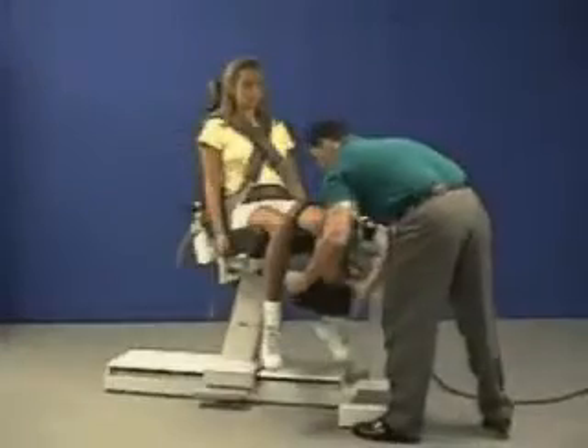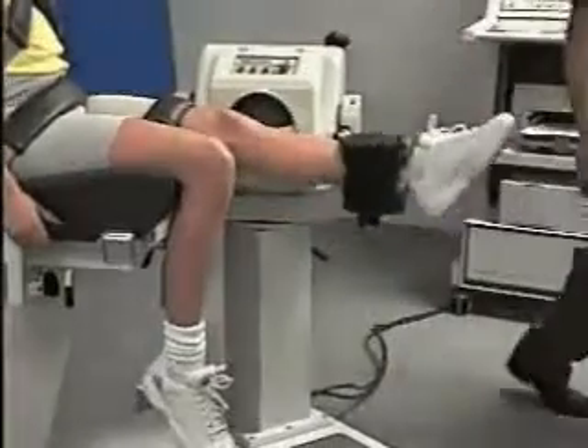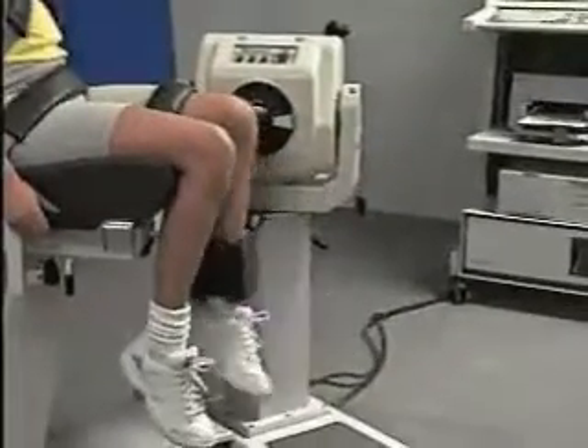Secure the shin pad proximal to the medial malleolus. Set stops and verify the patient's range of motion.